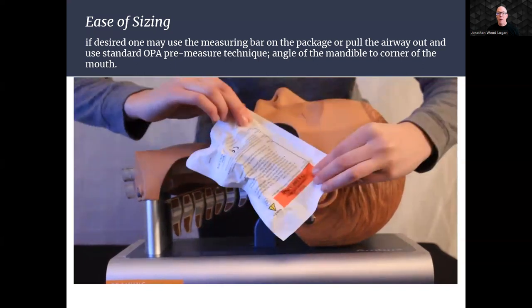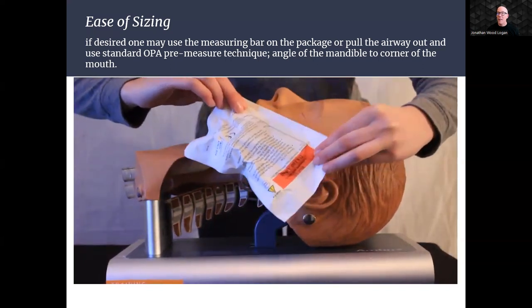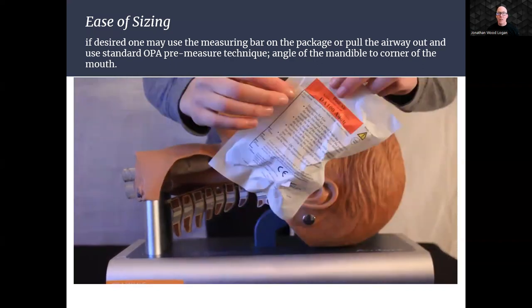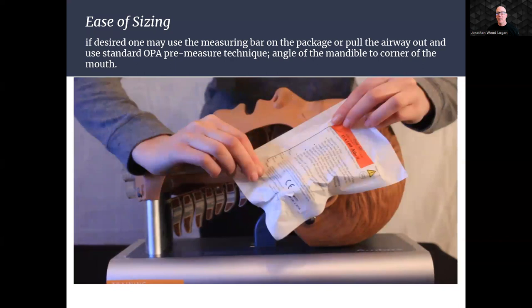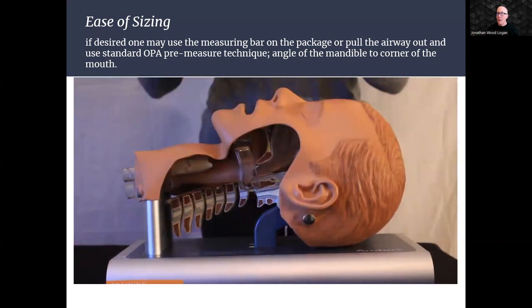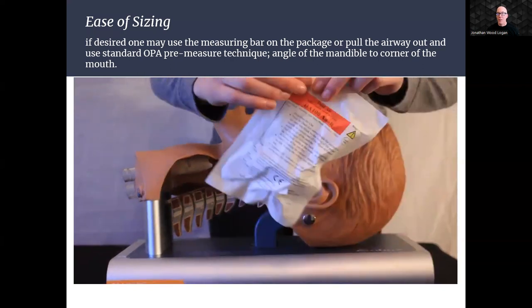Option two: if you prefer a more traditional approach, the NuZone Dual Air OPA can be sized using the standard OPA pre-measurement technique. Simply align the airway from the angle of the mandible to the corner of the mouth to determine the correct size for your patient.